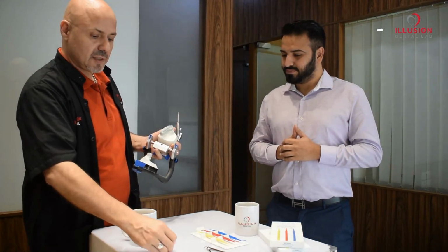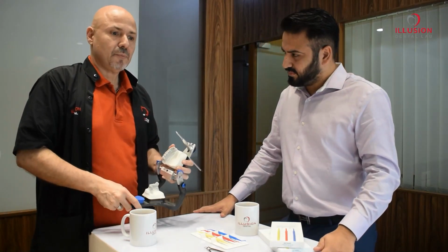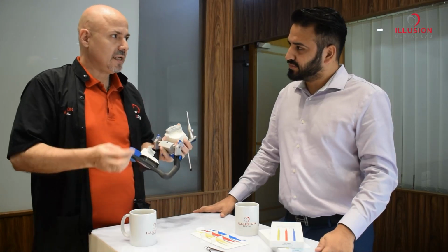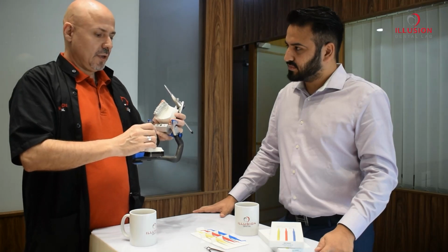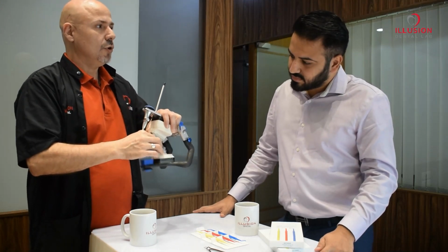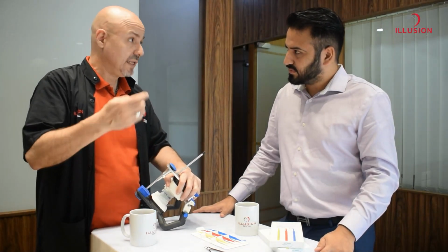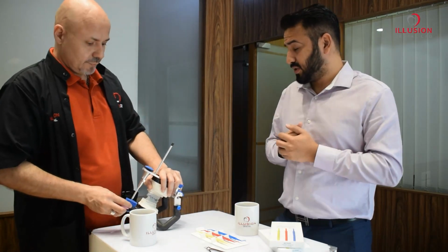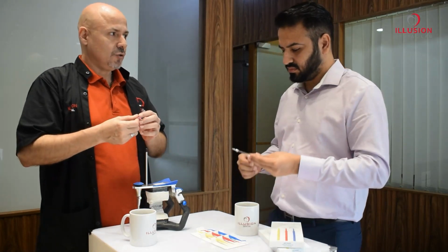What I experience when I speak with clinicians is that many take the impression first, and then take the bite material and send the bite to us in the lab. And we mount it with the bite. Yes. So now we could just reverse the story.